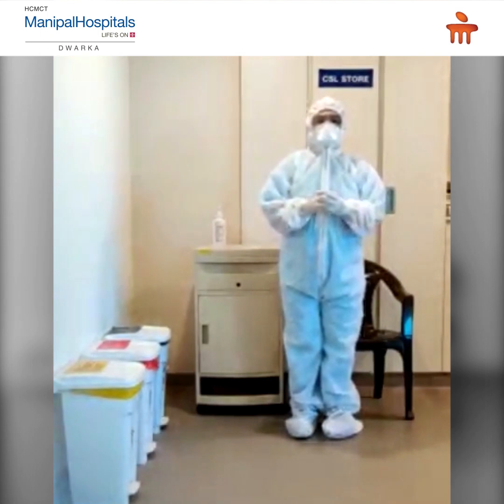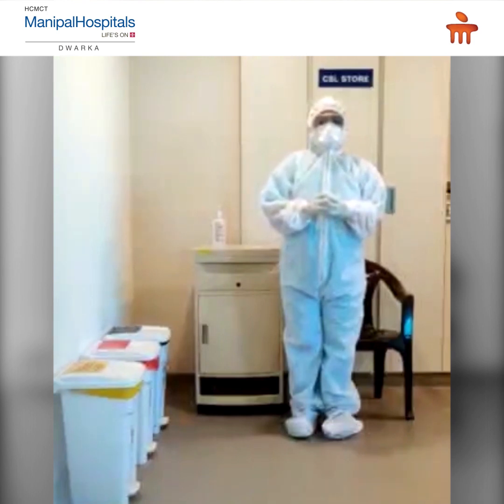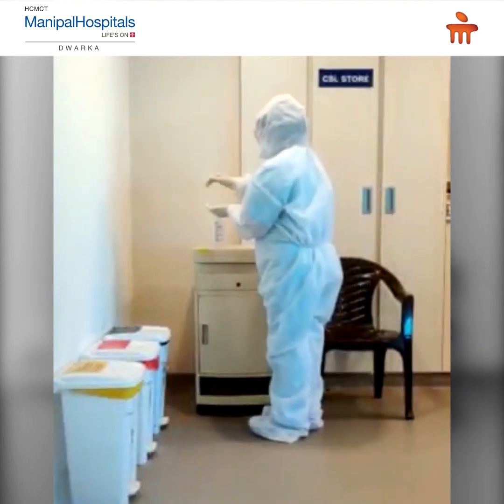Now, steps of doffing. Doffing is to be performed in a designated area. We must safely remove our personal protective equipment without contaminating our clothing, skin, or mucous membranes with potentially infectious material. First, perform hand hygiene with an alcohol-based hand rub.